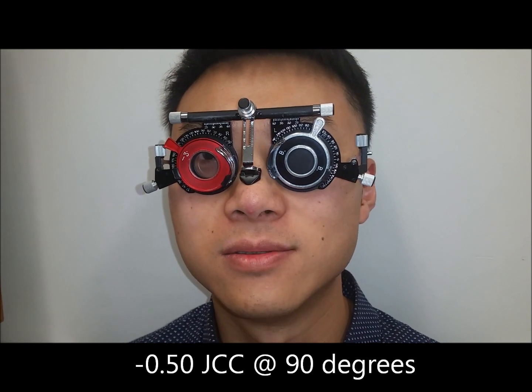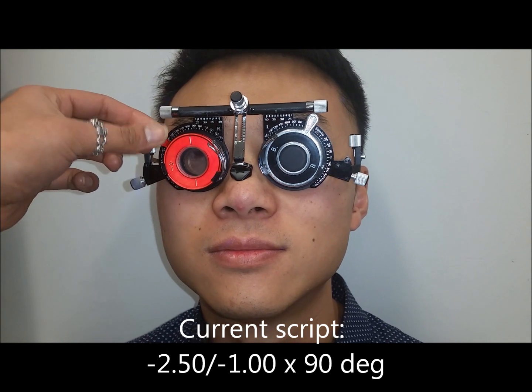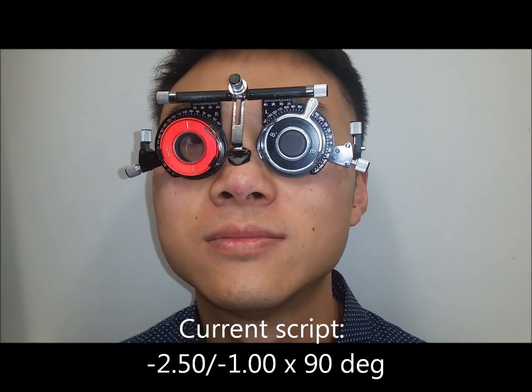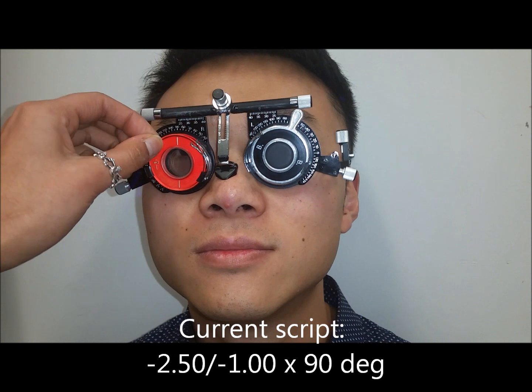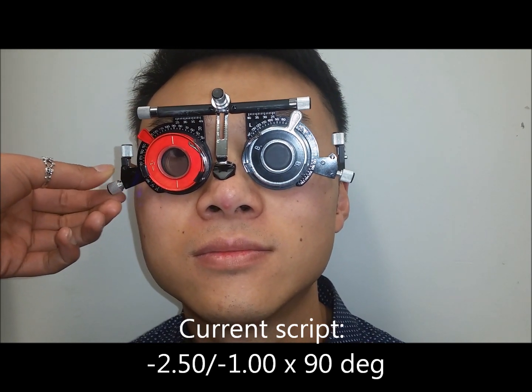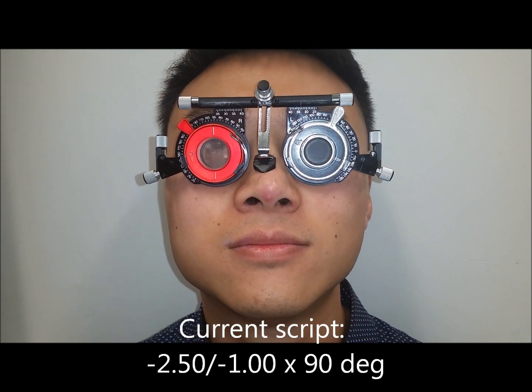It's better with. The orthoptist now inserts a minus 1 cylinder at 90 degrees, which will push the circle of least confusion away from the retina. Therefore, it is essential that a plus 0.50 diopter sphere is added to compensate for the unwanted spherical effect, therefore pushing the circle of least confusion back onto the retina. Therefore, the minus 3 diopter sphere lens is now changed to minus 2.5.